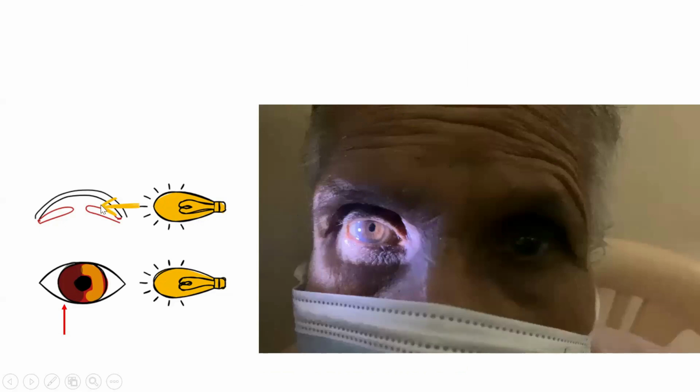If your anterior chamber is shallow, please have a look here. If the anterior chamber is shallow, light will not pass across the anterior chamber and it will not illuminate the opposite limbus. So you see a dark area in the nasal half of the anterior chamber. This is called the eclipse sign.